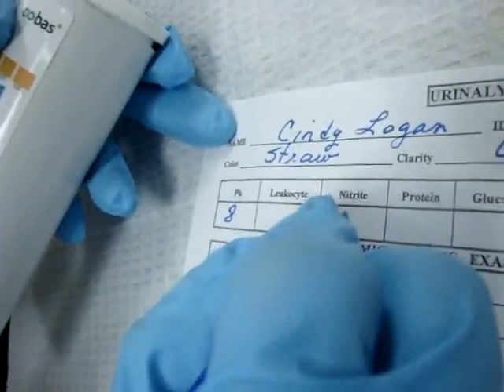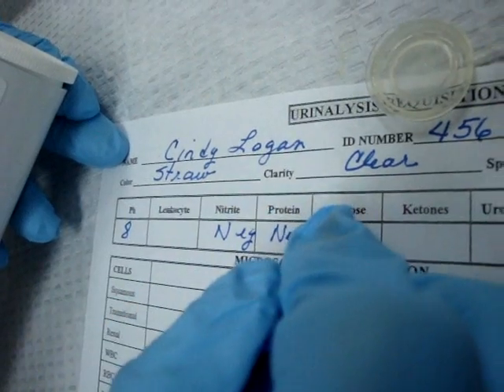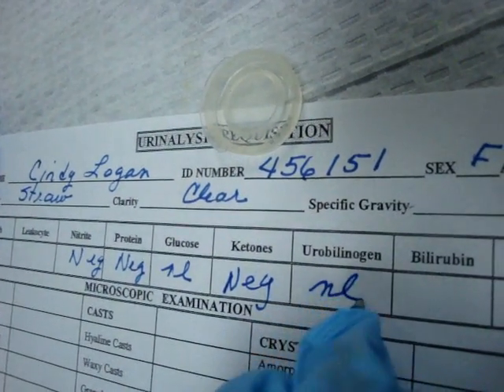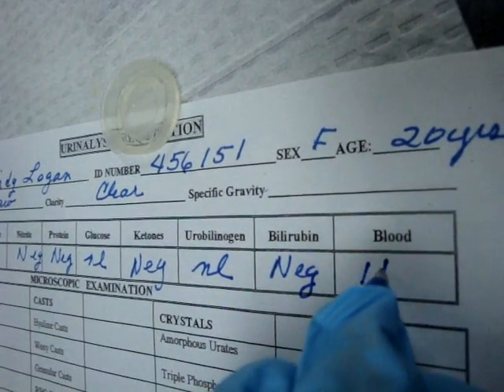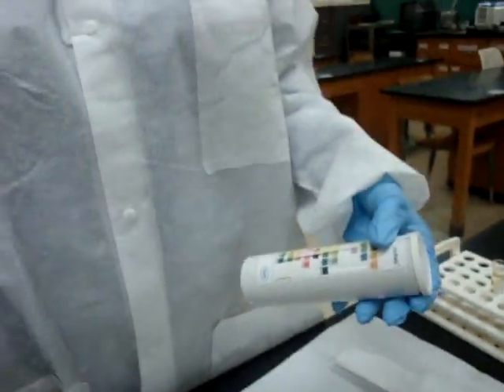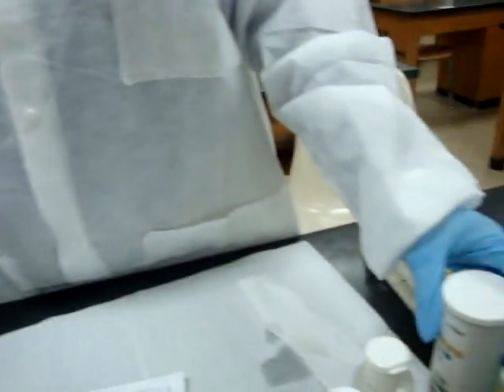We write down our results: pH is 8, nitrites negative, protein negative, glucose — we write that as normal because there's always a little glucose — ketones negative, urobilinogen normal, bilirubin negative, and 1 plus blood. We come back and read our leukocytes, and we can see now that the leukocytes are negative. Your urinalysis dipstick is done except for your refractometer. We throw the stick in the biohazard, and we have completed a dipstick.